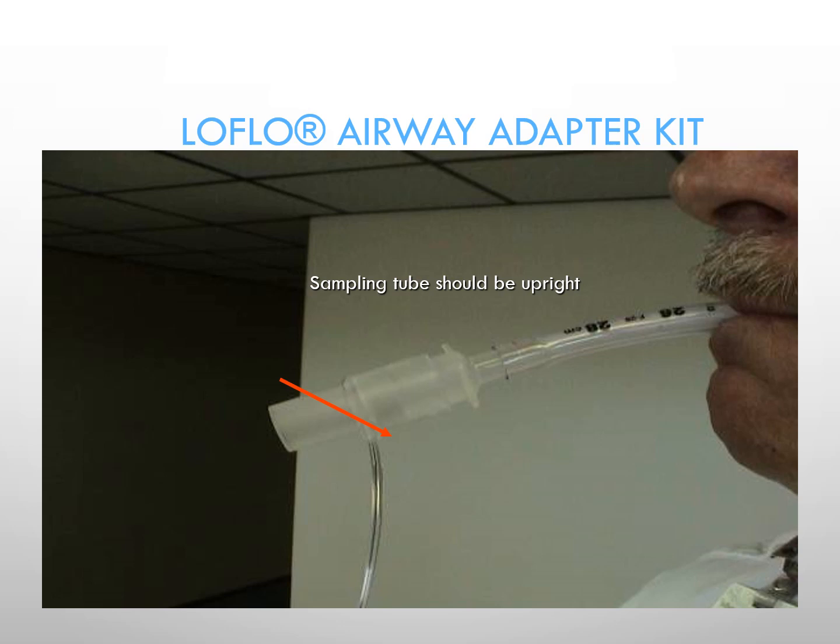So the point of it is, if you can avoid it altogether, you want to get your end-tidal CO2, but if you're using a sampling line adapter setup, you really need to try to make sure that the sampling tubing itself is facing upright. Talk to the nurse and nursing assistant to say, hey, if you're going to roll the patient, I can give you a hand, or if I'm not available, if you could just really concentrate on keeping that upright.